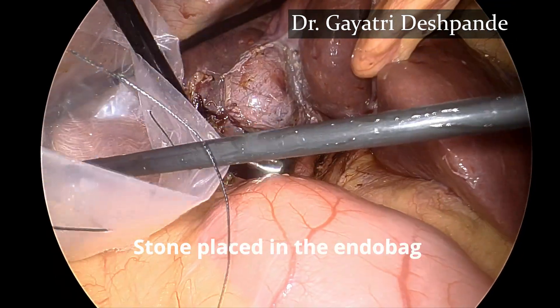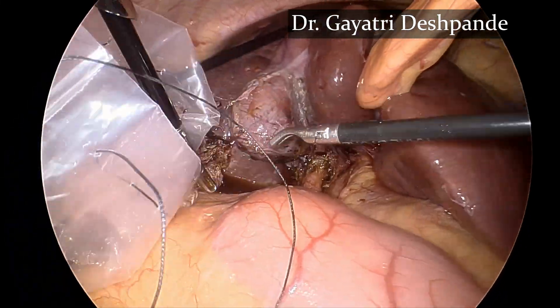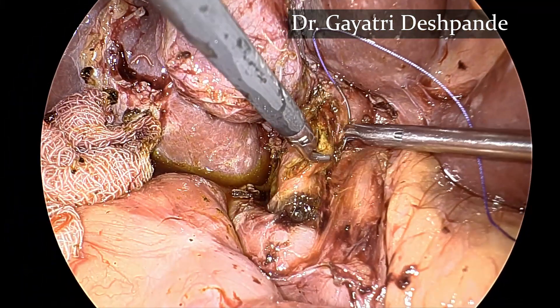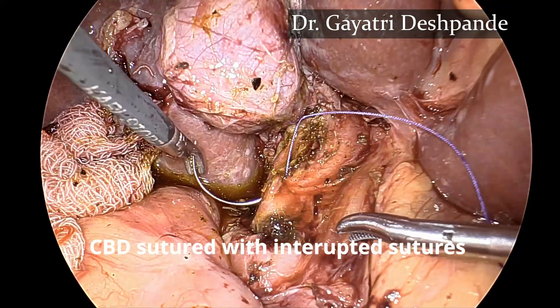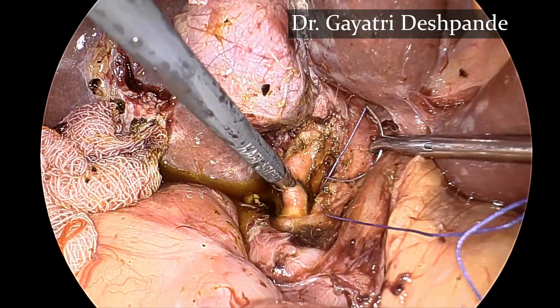The stone was placed in the endobag, and the opening in the CBD was sutured with interrupted absorbable sutures.